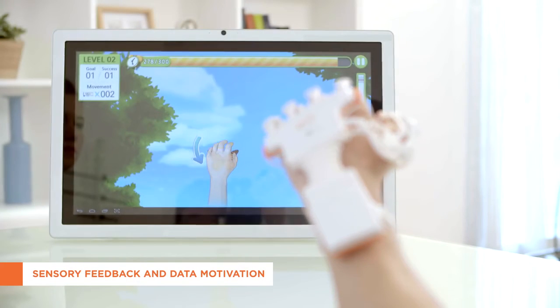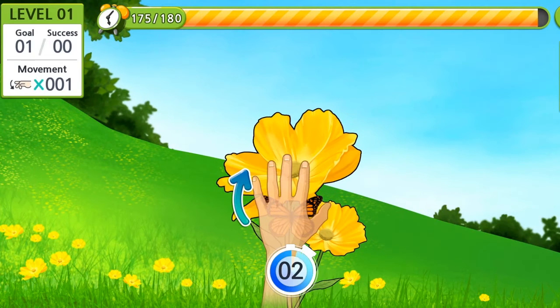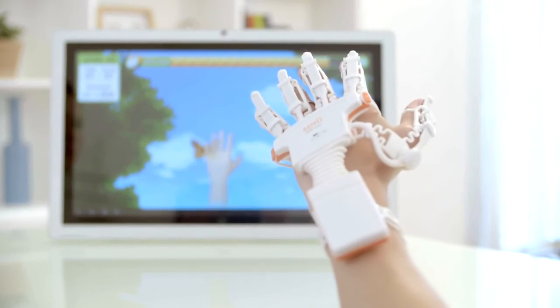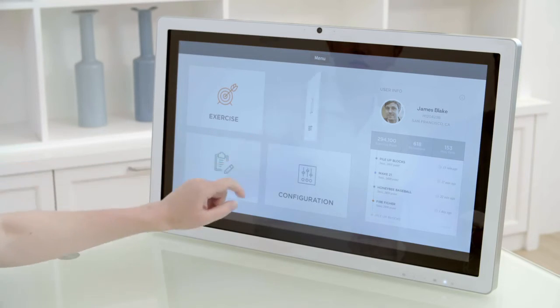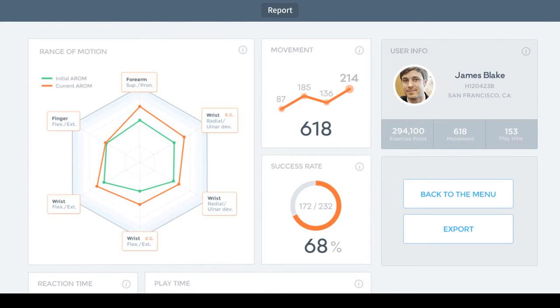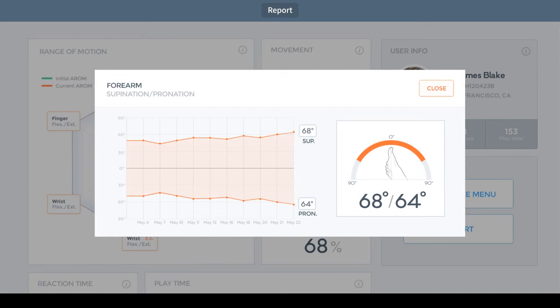Raphael Smart Glove does not miss a single movement made by a patient and measures them with high precision, immediately returning visual and audio feedback. Such a process helps patients to perform more precise movement. Also, Raphael continuously records all the practices of patients during the process and displays them on an integrated data form, thus increasing their motivation.